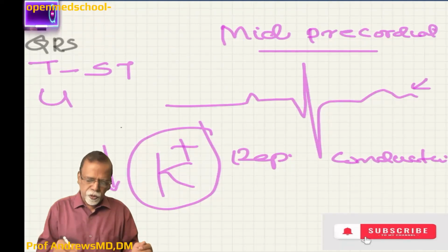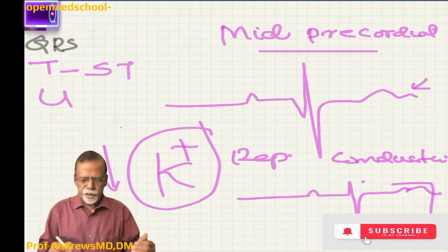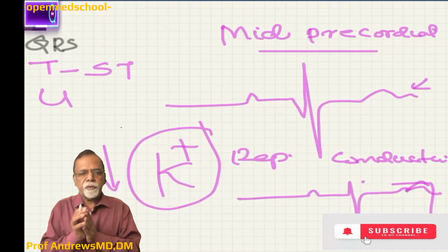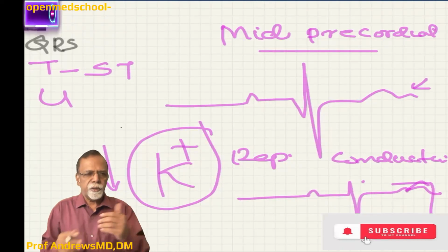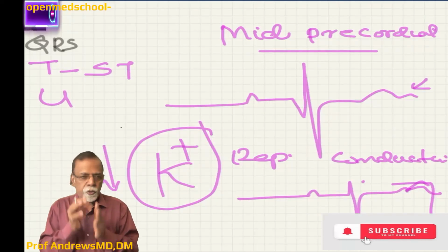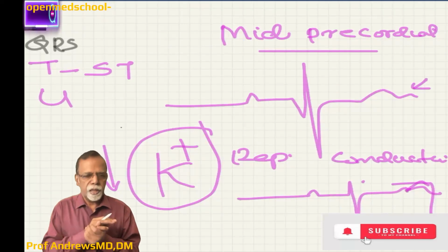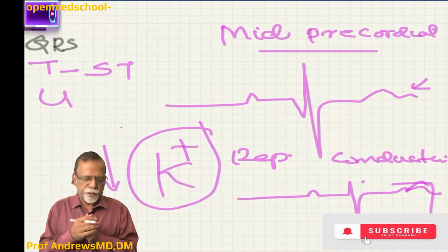When the U wave is prominent, the T will not be much prominent and the U becomes prominent, and it will appear as an apparent QT prolongation. It can be confused as a QT prolongation. That's the significance. Again, remember a patient with diabetic ketoacidosis. You are checking the electrocardiogram. If the U wave is prominent, it indicates significant hypokalemia, and you should be careful in administering insulin. You have to correct the potassium, then we go for insulin. Otherwise, the patient can develop arrhythmias.